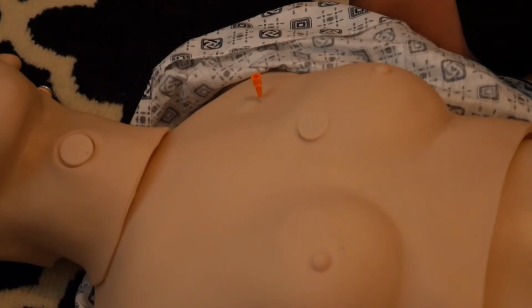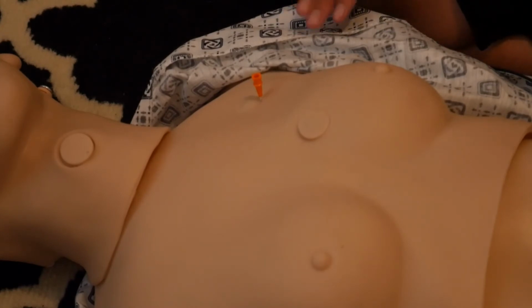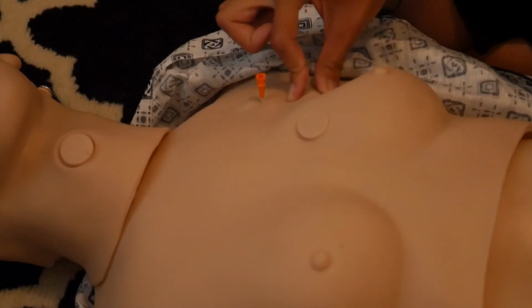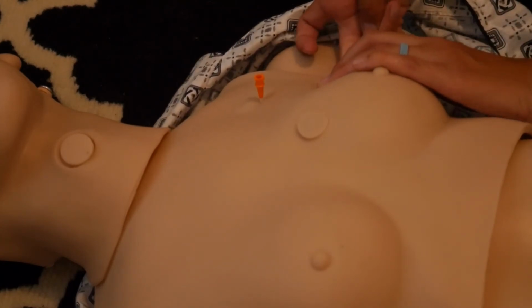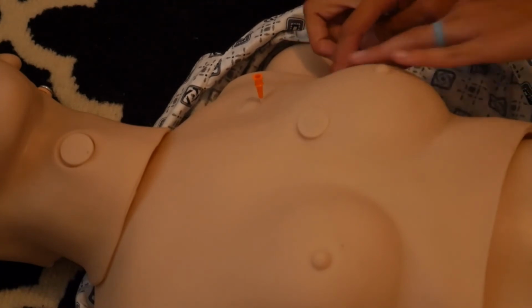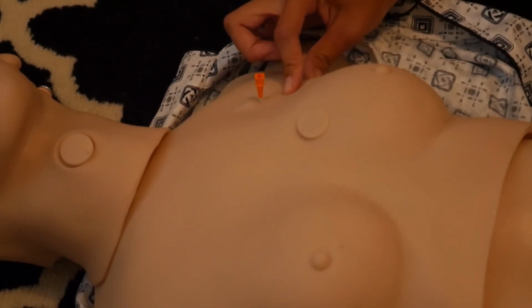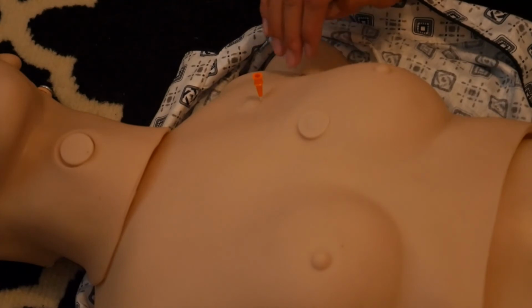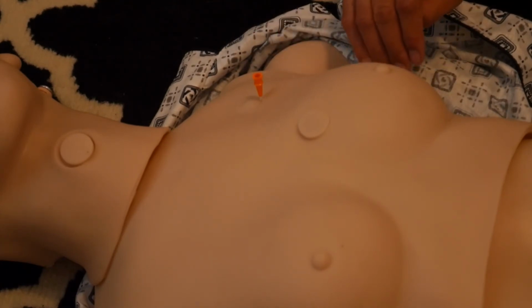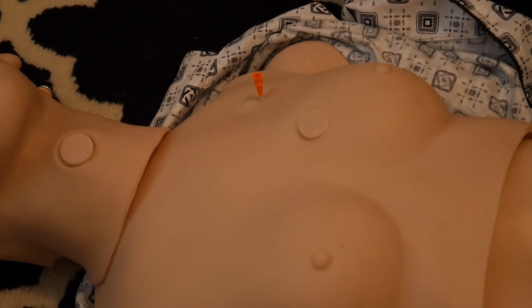Okay, so the two other sites are the mid-axillary line, so it's this way, third and fourth intercostal space. So this is the second, third, fourth, and it's going to be just right underneath this arm. In most cases, they tell you to go down to the fourth, so this mannequin is not entirely accurate. So just be right underneath the armpit, and you could do a needle decompression there. Then there's also the anterior axillary line at the fifth intercostal space. Those are the two other sites that you can use to attempt to get a good needle decompression.